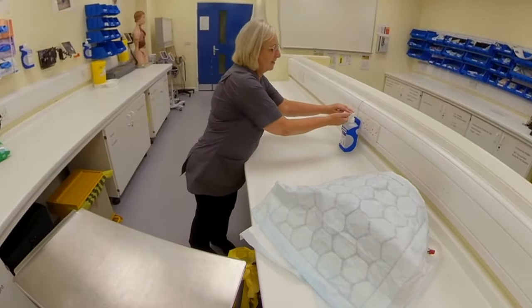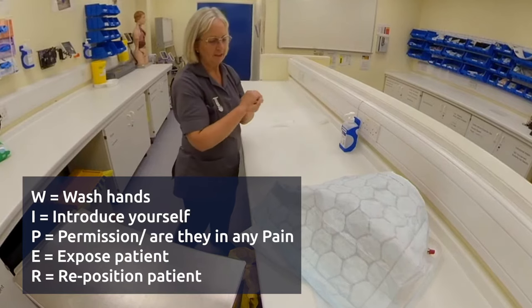Hello Mrs Jones, my name is Annette. I've been asked to pop a catheter in. Will that be alright?